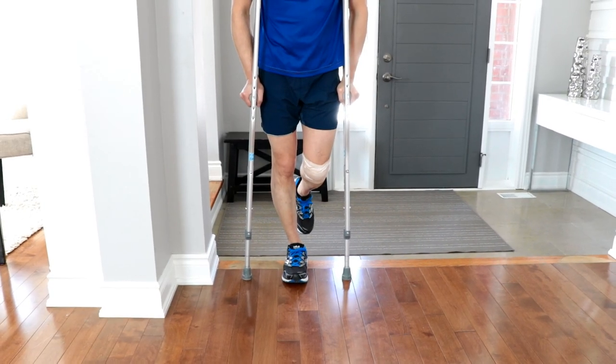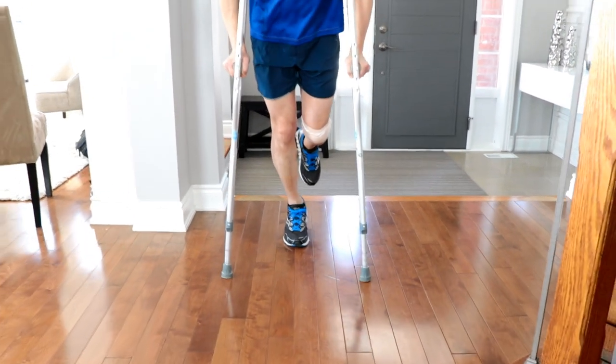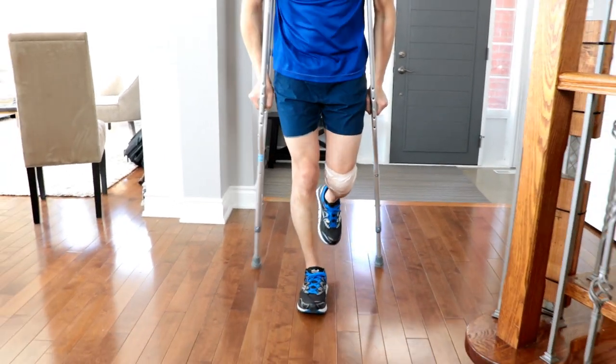Your weight should be on the handles, not the axillary pads, and the crutches are advanced together. The strong leg steps past the crutches and the cycle repeats.